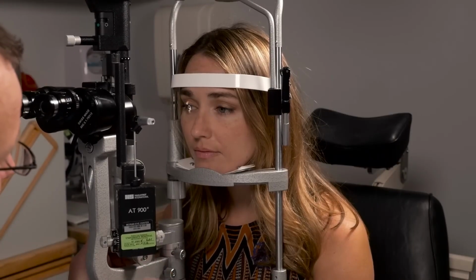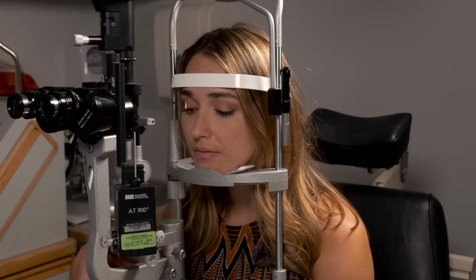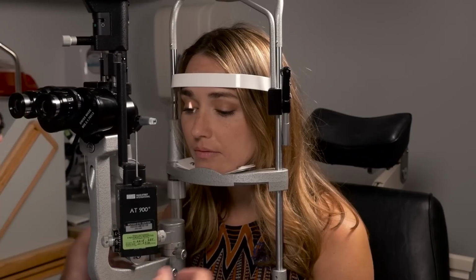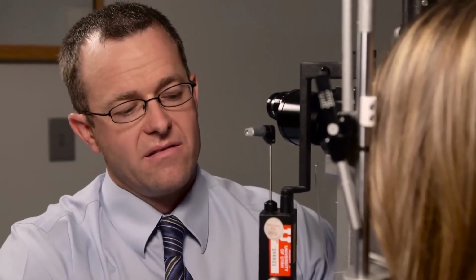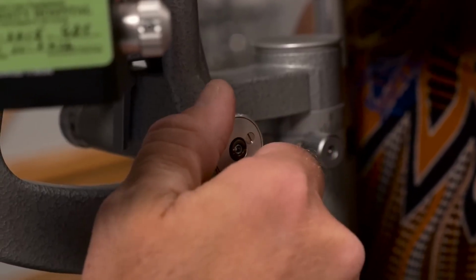Also on the slit lamp, these are the main two knobs you're going to use. This upper knob controls the lateral movement of the beam, the side-to-side movement of the beam. It also increases the width. And so by spinning the knob, and you can actually go all the way in and all the way out and spin it all the way around, you widen the beam. And so at different parts of the exam, you're going to widen or narrow the beam depending on what you're looking at.